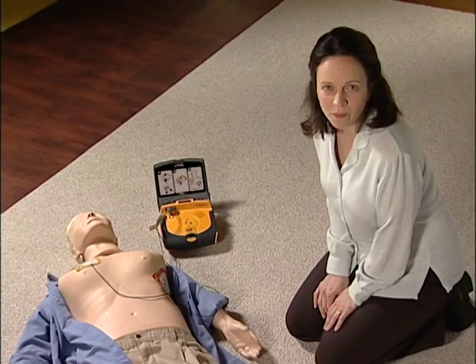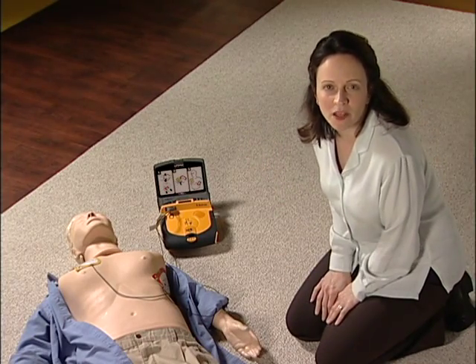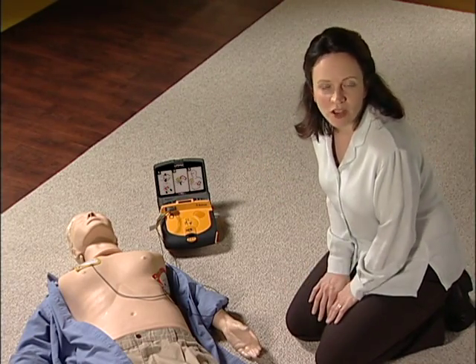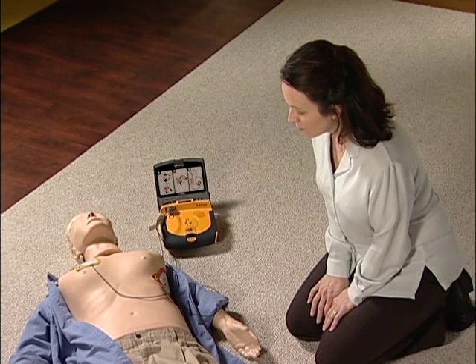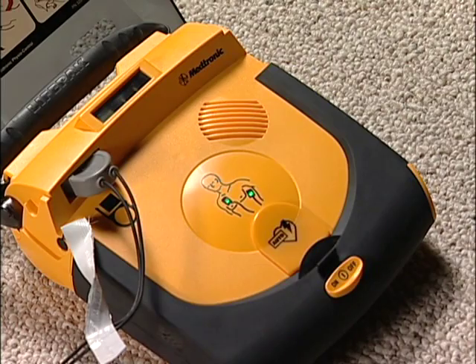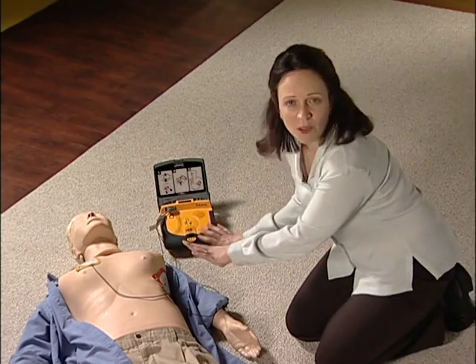Evaluating heart rhythm. Keep staying clear of the patient while the LifePAK AED is reevaluating. It might decide to shock again, or it might say, No shock advised. Provide chest compressions and rescue breaths. Even if they start to move or breathe normally, don't take the pads off.